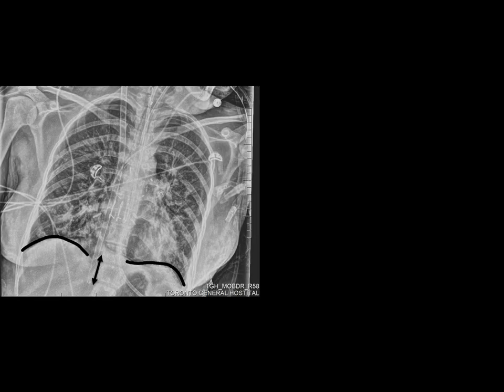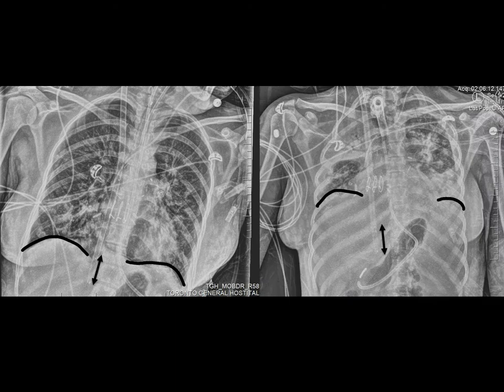And the explanation for that is the fact that initially the tip of the cannula in relationship to the diaphragm was about 4 centimeters. But what happens usually is that as soon as the patient is on ECMO, we tend to decrease the ventilator settings so that they're not injurious anymore. And that is associated with a significant loss in lung volumes. And when that happens, the diaphragm may actually shift upwards and the relative position of the tip of the cannula and the diaphragm is significantly different, to the point that the reinjection hole, which was initially in the middle of the right atrium, was now intrahepatic.